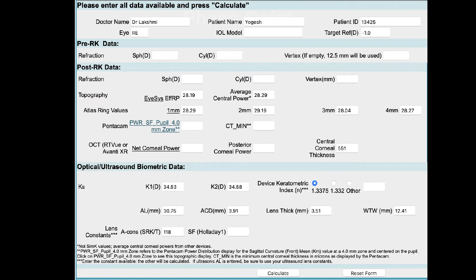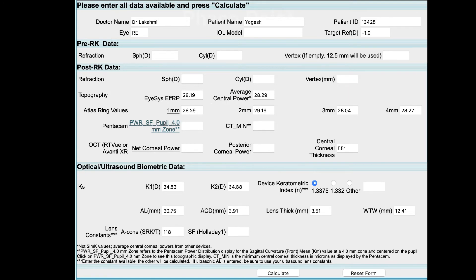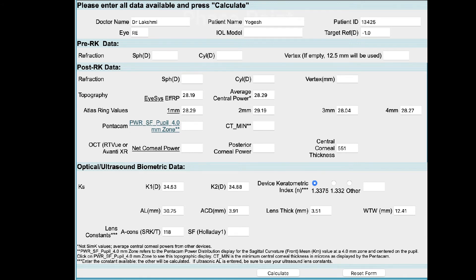For OCT-based systems, the net corneal power, posterior corneal power, and central corneal thickness are required. Topography is of significant importance not only for obtaining these values, but also for assessing the quality of the central cornea — whether it is regular, irregular, regularly irregular, or irregularly irregular. An irregularly irregular cornea signals a likely suboptimal outcome, as it causes significant aberrations, reduced visual quality, and reduced corneal contrast.